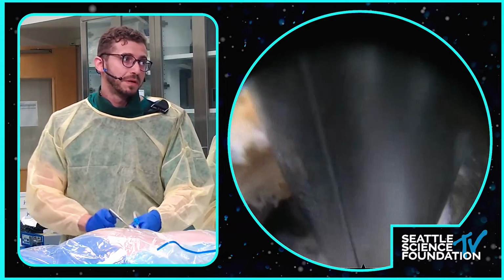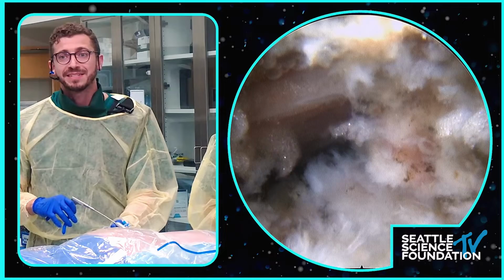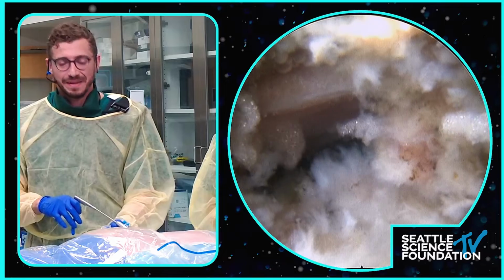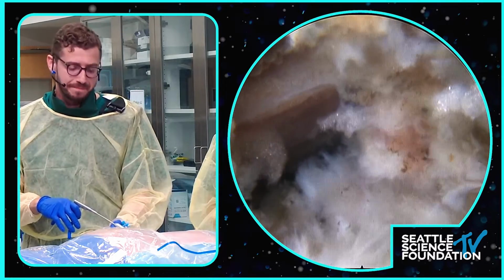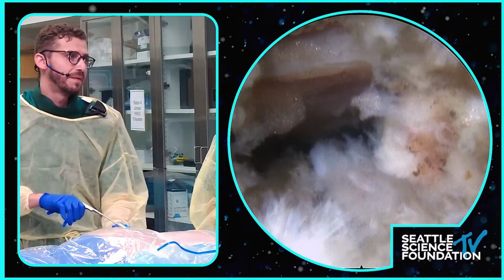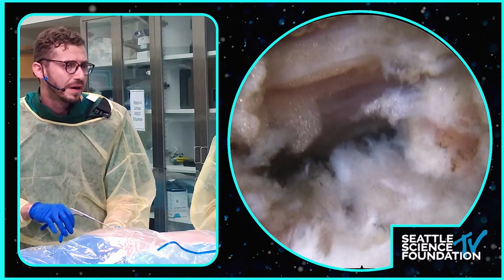Hey, Osama, two things. Beautiful technique. I really like your handwork there. It's gorgeously coordinated. Everybody watching right now can see how he holds the endoscope to the tool at 90 degrees all the time, and this is why he gets this beautiful visualization. He does not block himself. Two little things: would you mind showing us how to drill down the marginal osteophyte? That's what I've learned from Dr. Ralph Wagner. He does that always, and it's really helpful to get some extra space. And the second thing is, can you show us how you go up to the exiting nerve root?